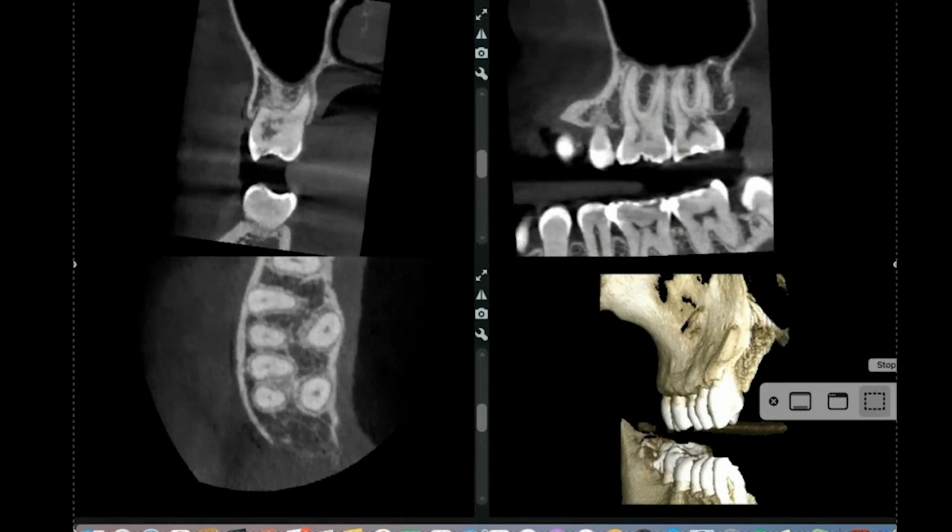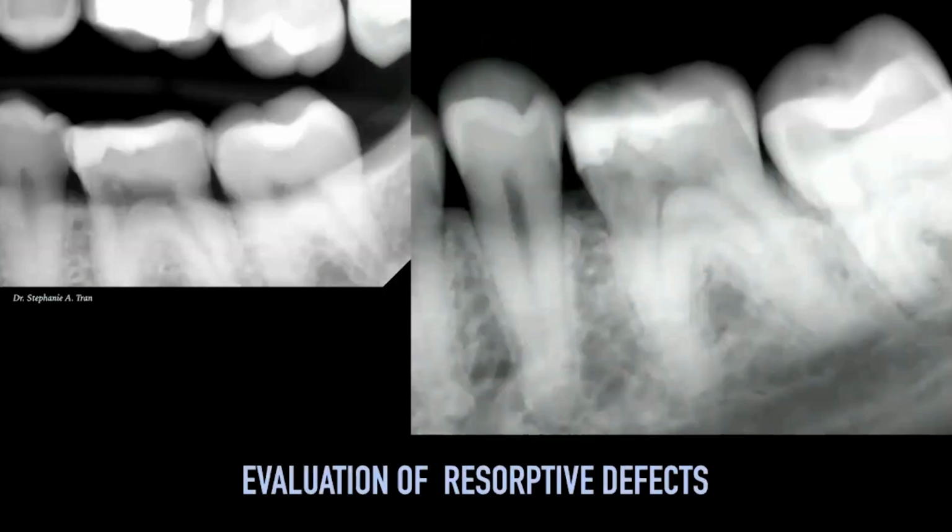We could see from these scans, as well as scrolling through them, that ECIR was very extensive. It extended to the palatal area and down the cervical area, and so this let us know ahead of time that unfortunately this tooth was not able to be treated.